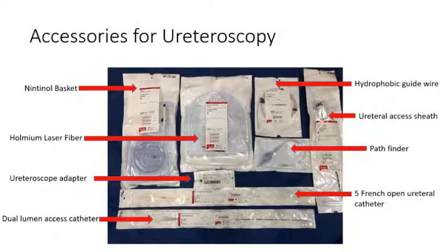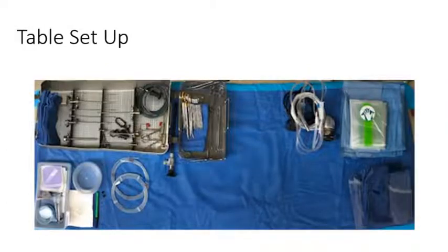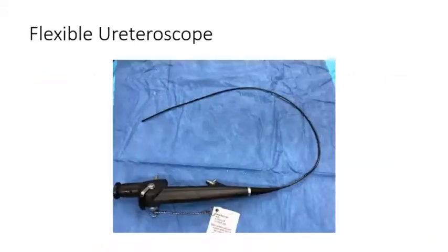It is important to gather all the accessories necessary for the procedure. The other basic instruments necessary are a pediatric cystoscopy set, a C-arm drape, saline for irrigation, radio-opaque contrast, lubricating jelly, and lidocaine viscous for injection into the urethra at the end of the procedure.